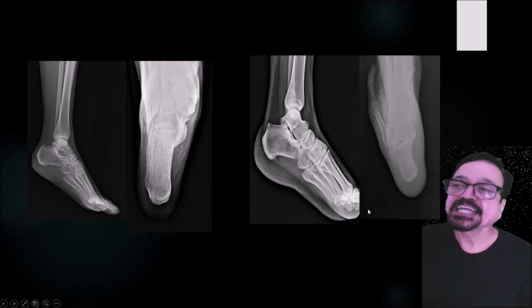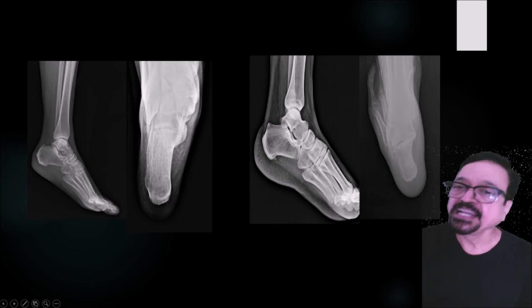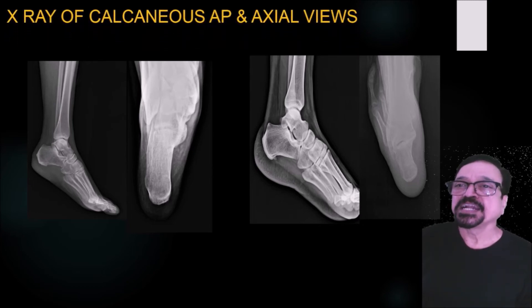The second is the axial projection. Here you are seeing it is somewhat shortened. So if that is the case, your angulation needs to be improvised. This is the good angulation — you are getting a good elongated calcaneus, whereas here you are getting it shortened. This has to be kept in mind when you are reviewing a radiograph. If you are seeing a shortened calcaneus, correct the angulation and repeat the exposure.